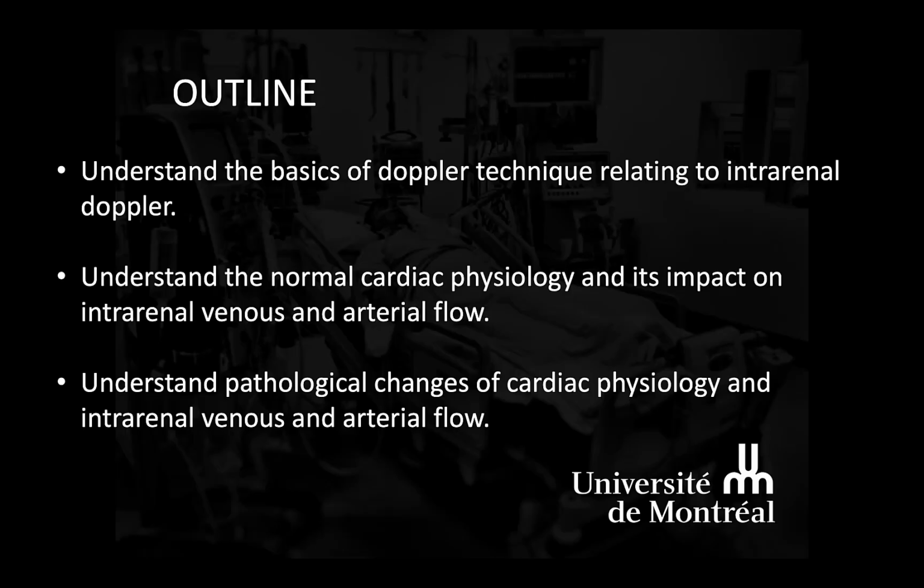At the end of this video, you will be able to understand the basics of Doppler technique relating to intrarenal Doppler, understand the normal cardiac physiology and its impact on intrarenal venous and arterial flow, and understand pathological changes of cardiac physiology and intrarenal venous and arterial flow.